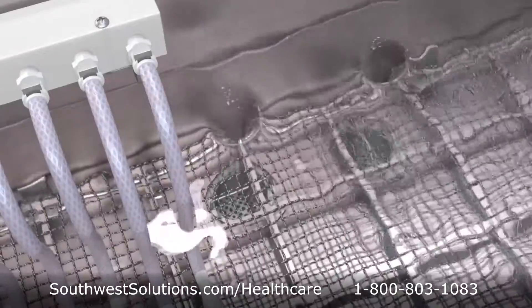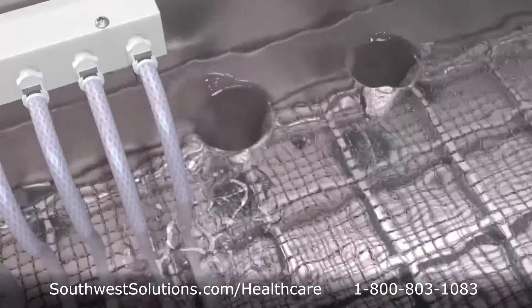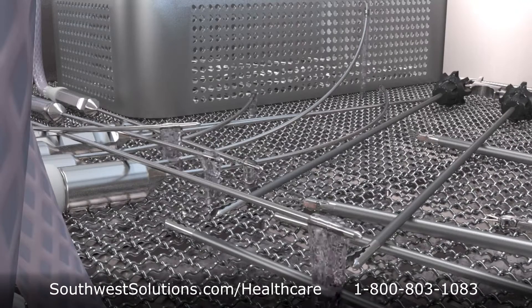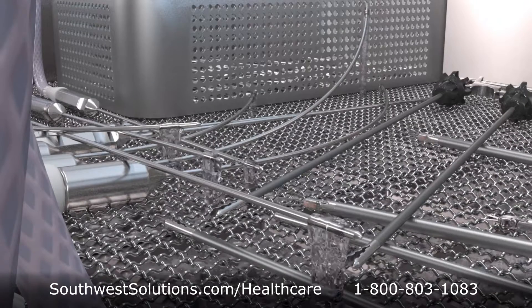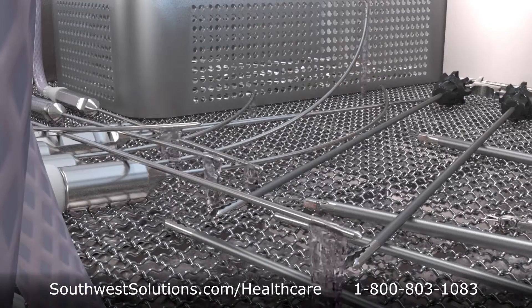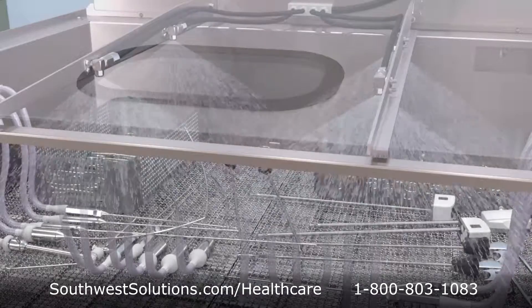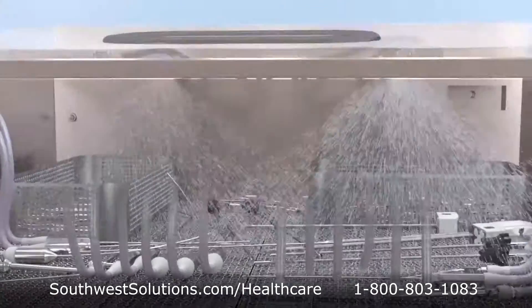At the conclusion of this sequence, the drains are opened and the wash tank empties. The interior of the cannulated instruments are rinsed with 196 degree fresh water for 4 minutes, followed by an exterior rinse with 196 degree fresh water for another 4 minutes.